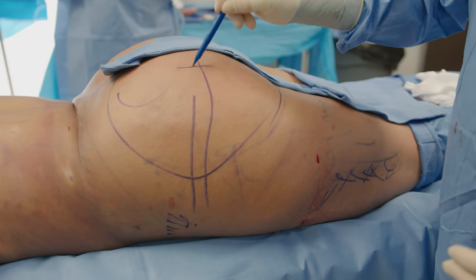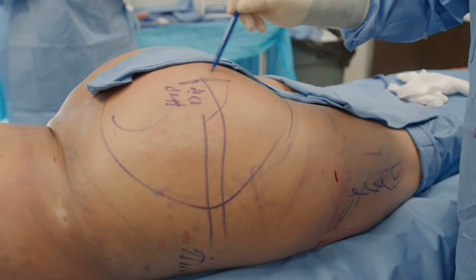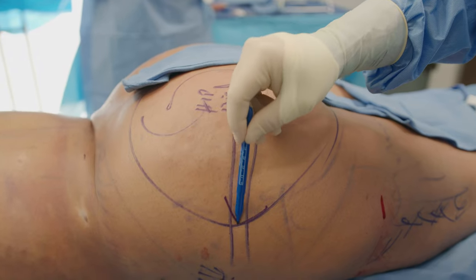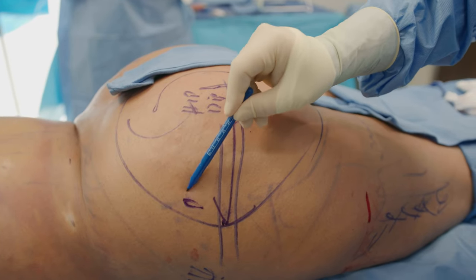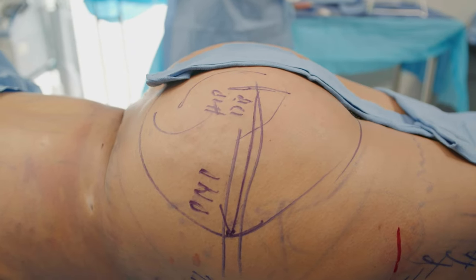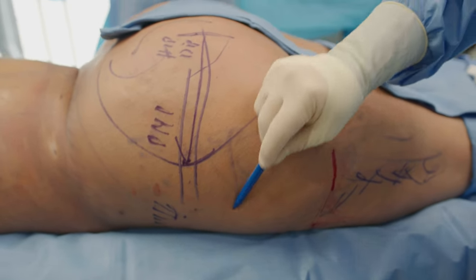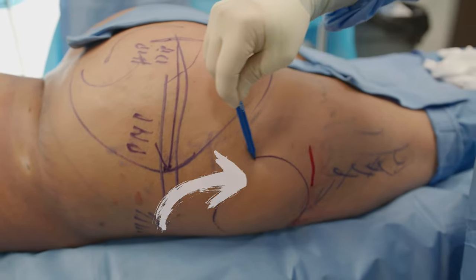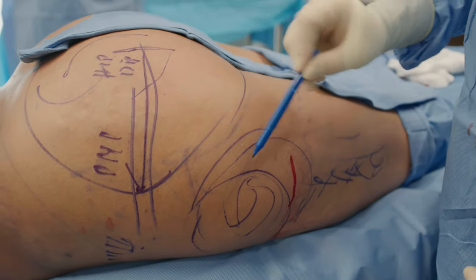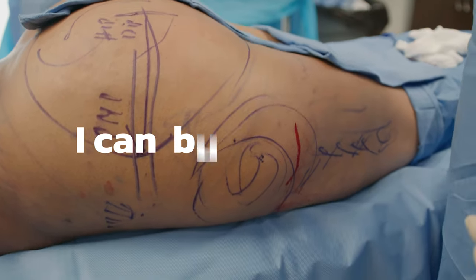Remember the hip dip starts from about here and so I have to fill a little bit here to begin with, and then I'm going to now concentrate on where I want this point of maximal projection, which is right here. But there's a couple things going on. So I have to fill that hip dip in. She's got a really nice collection of fat that's right here that she came with, which is really great because I can build off this.